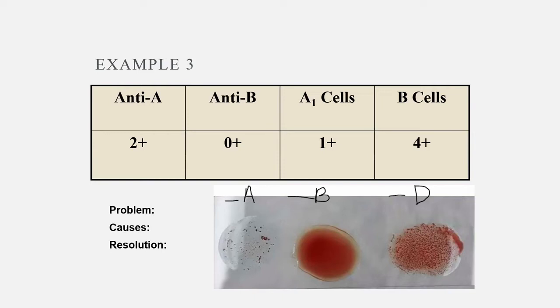And then we also have anti-A1 lectin, which may or may not be in your reagent rack now. I don't know if you guys have seen anything about lectins yet. Lectins are basically antisera made from seeds. It's kind of weird, because how did people know?